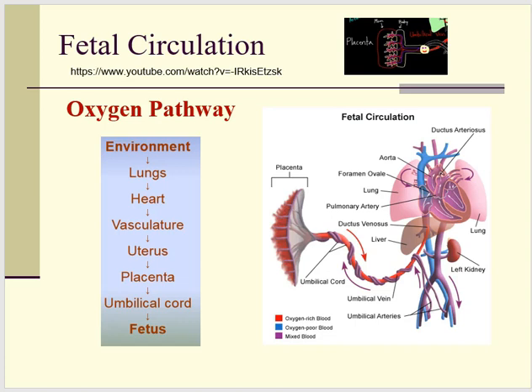In order to understand fetal heart rate monitoring, you need to have a basic understanding of the physiology between the placenta and the fetus. I strongly encourage you to watch the video, if you haven't yet, posted in the Canvas course under the lecture videos. The little Khan Academy video explains this very well in 10 or 15 minutes.